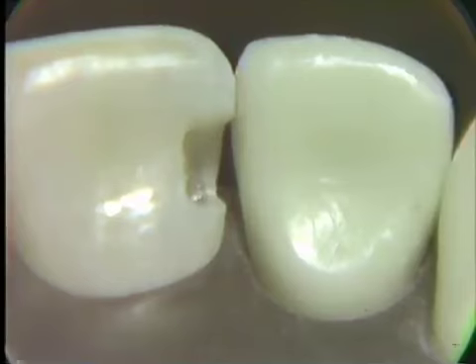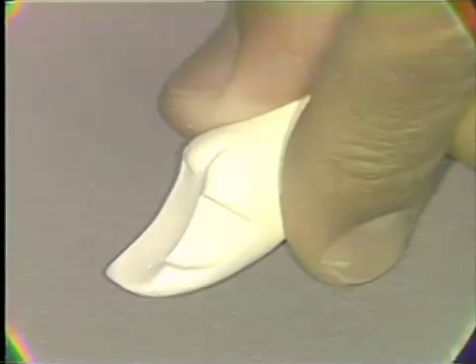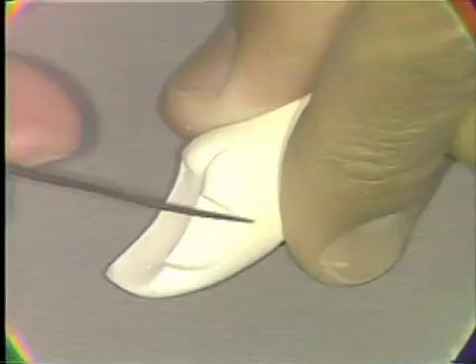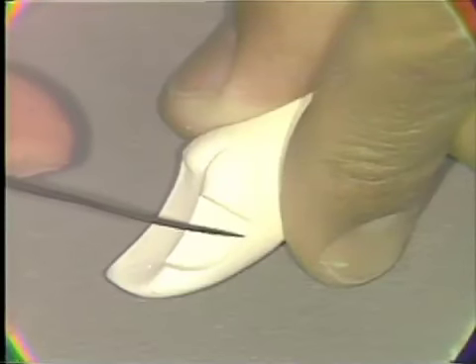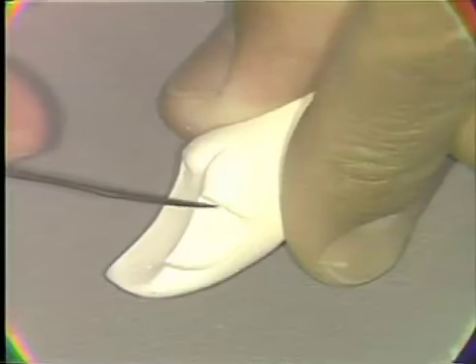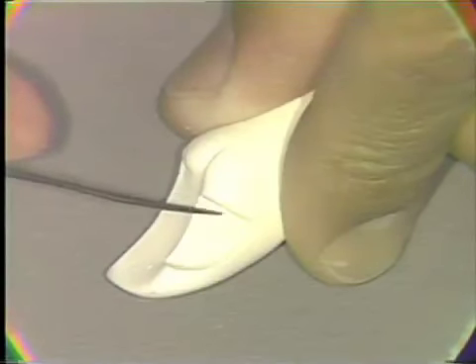Looking at a model of the preparation, we see the outline form, again with this sweeping curvature from incisal across the labial wall down to the labial cervical position. The lingual cervical area is more incisally placed than is the labial.